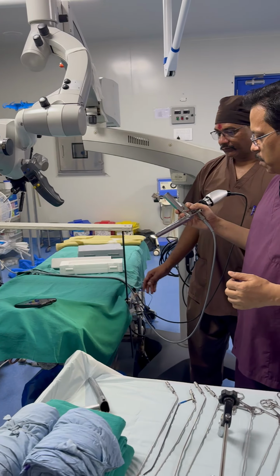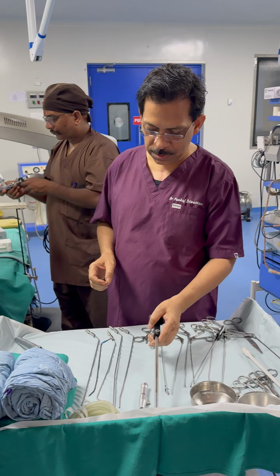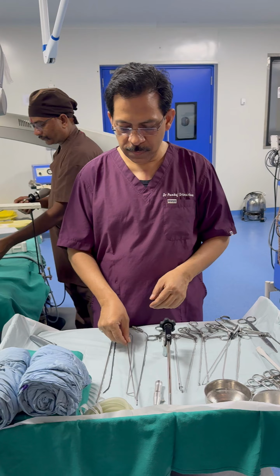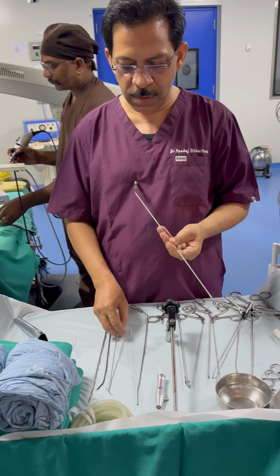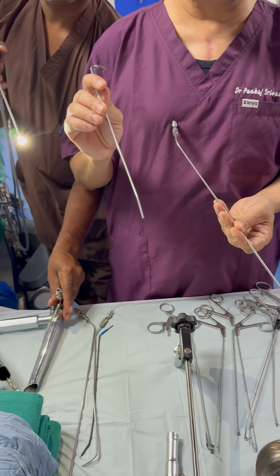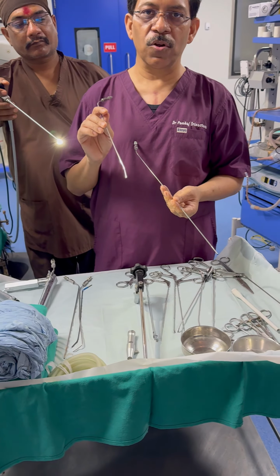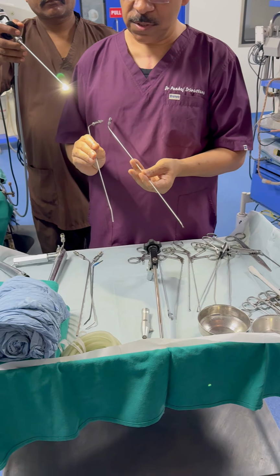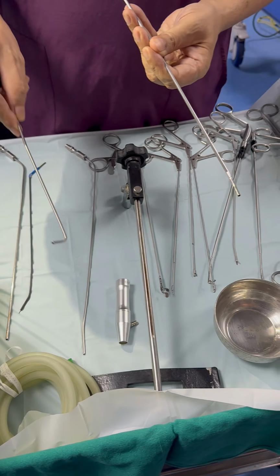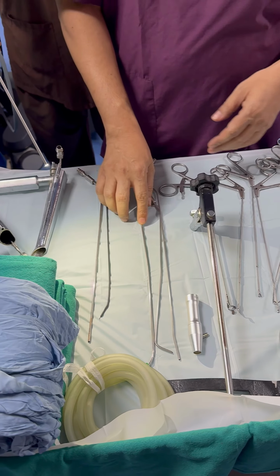So what are the instruments or adjustments which can be helpful in seeing anterior commissure? So seeing is that, and working. Now we have 3 suctions available. We have to turn our instruments because we can see the lesion, but touching, doing suction or operating becomes difficult. So for suction, we have 3 tilts: mild tilt, moderate, and too much tilt. So whatever the situation, we can use the suction.